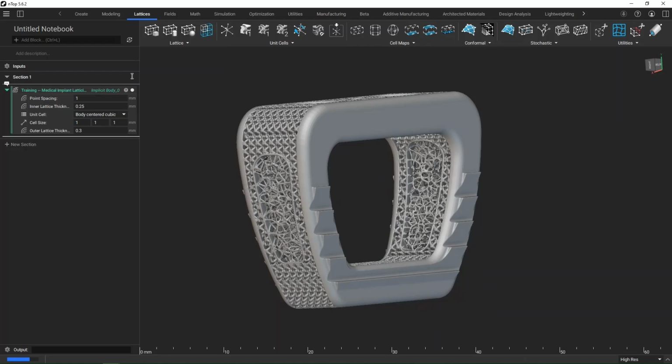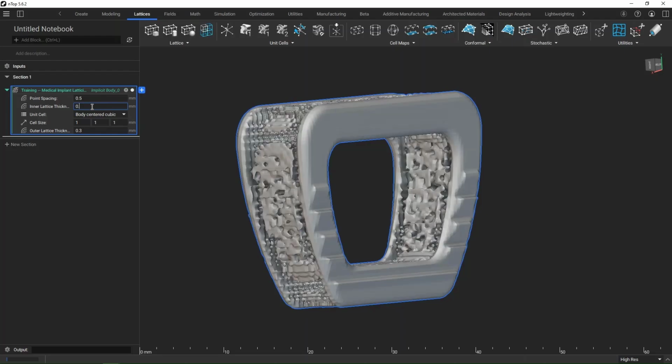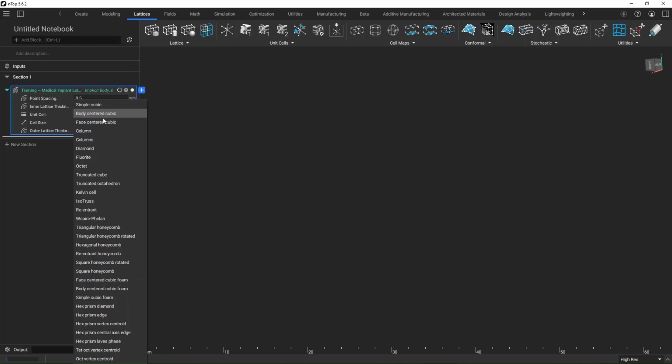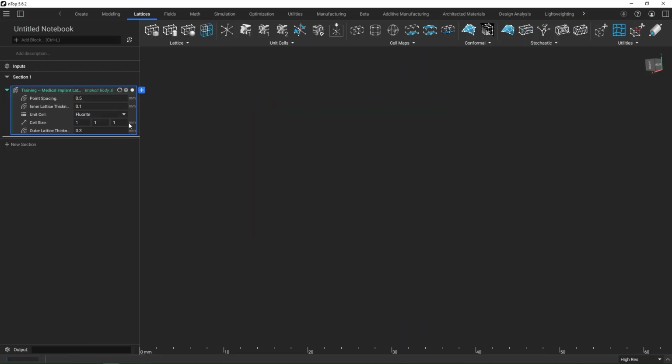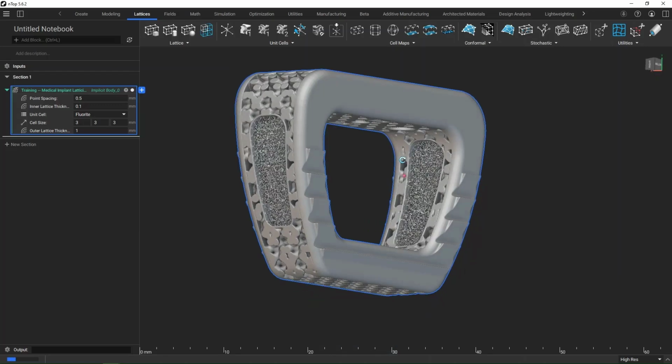And so very quickly, we can play around with these inputs, and we don't even have to think about what's happening in the background. So maybe let's make this a little bit denser. We could go with 0.5. Therefore, we'd probably have to bump this lattice down to be a little bit thinner as well. I could change this to perhaps a fluorite cell, and maybe I want to make that larger. There are so many different things that we can really play around with, and it's just going to rerun from there. So here, give it a second to render.